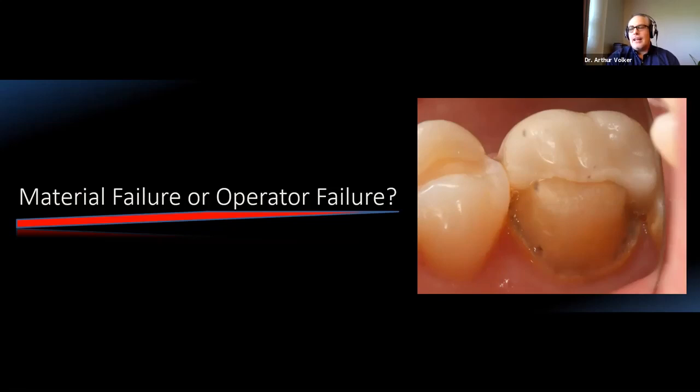I always say this in my class, but have any of you done a coping try-in? And when you look at a coping, it's quite thin. It can be no more really sometimes than 0.5 millimeter. But what is the occlusal reduction necessary for a standard PFM restoration? Okay, and we know it's 2 millimeters. But if the coping is so thin, why do we have to prepare so much? And of course the answer is because you're going to overlay that with an extremely weak material.